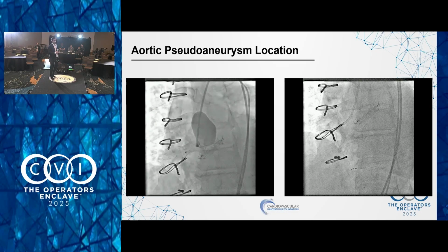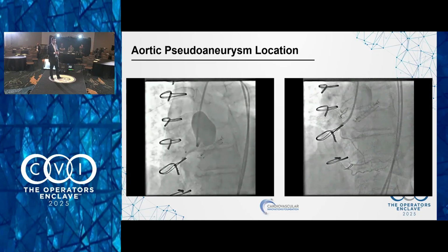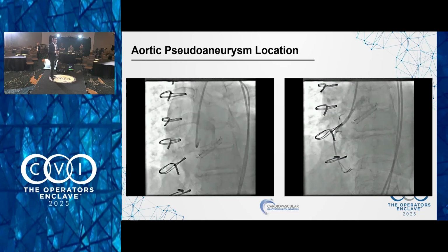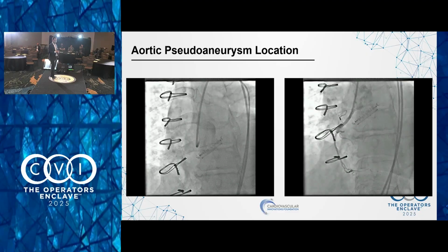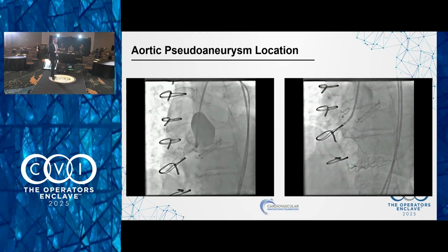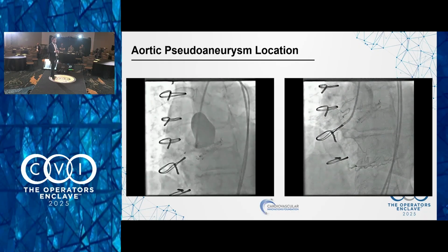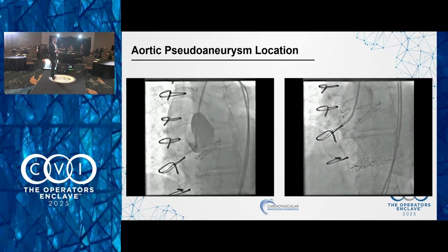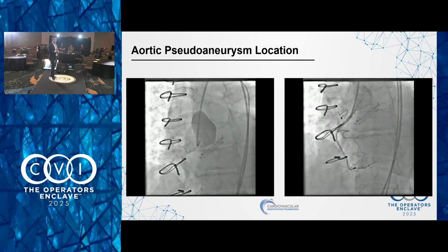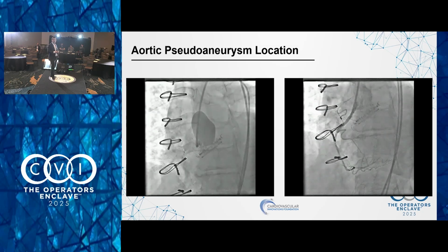I did a root angiogram. Based on the position, you could say something failed, but I couldn't see the origin. Knowing it was right close to the RCA, I positioned a JR guide right next to the RCA and just dropped into it, so I knew I was inside there. You can see the contrast nicely filling, and you can see the RCA, a pretty healthy vessel.